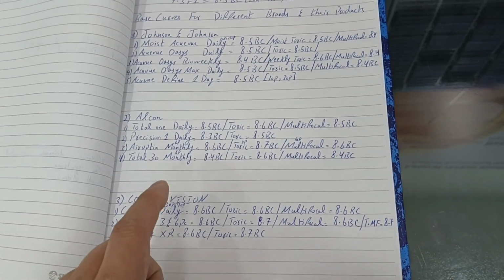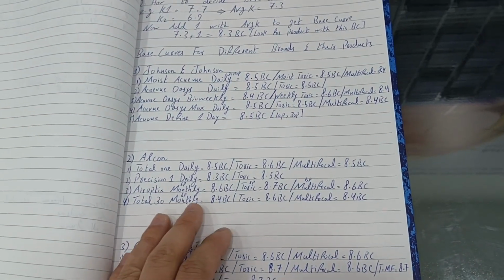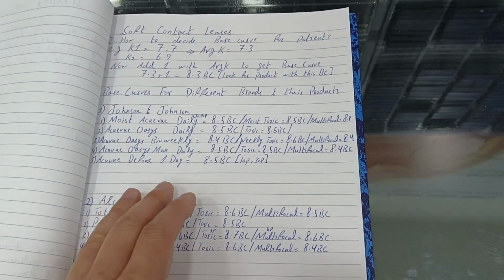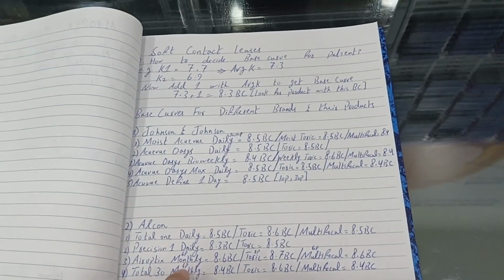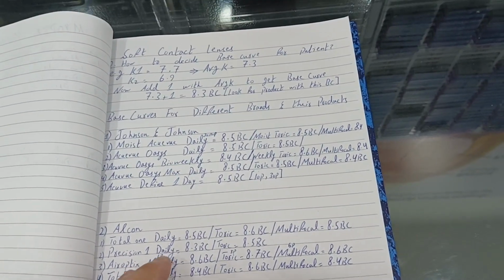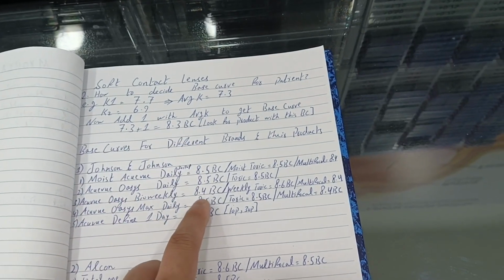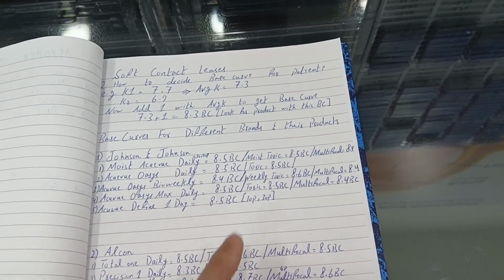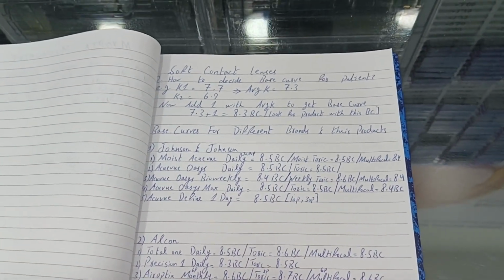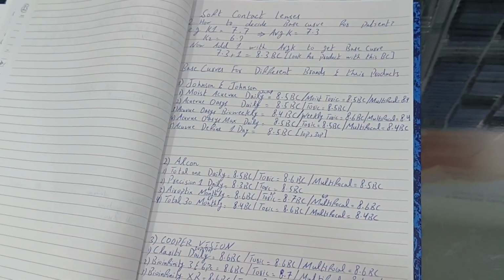But I want to add a bonus tip in the last. Let's say if you are unable to find the 8.3 in the brands that you are dealing with, you can go with the most matching one to this. Let's say if we don't have 8.3, we will be focusing on 8.4 max. We will not jump to 8.5 or 8.6, because it will cause more discomfort to the patient. So that was my final tip for you guys, and hope you have understood.